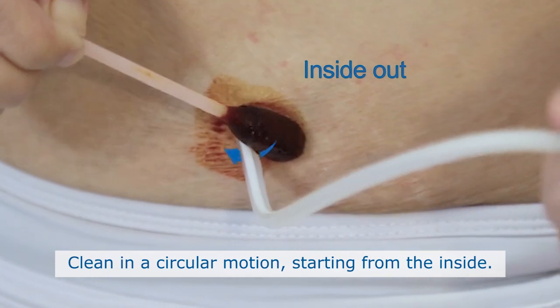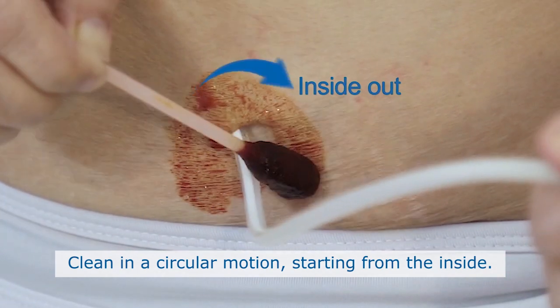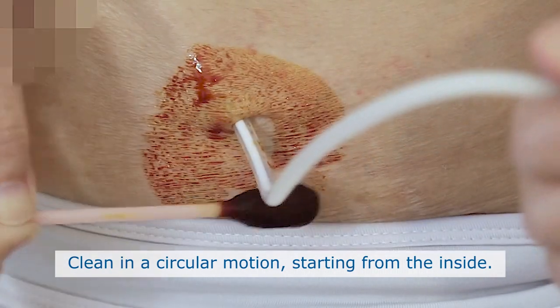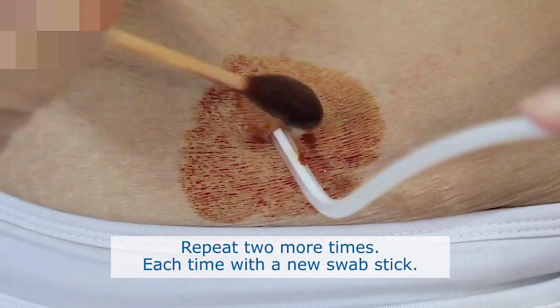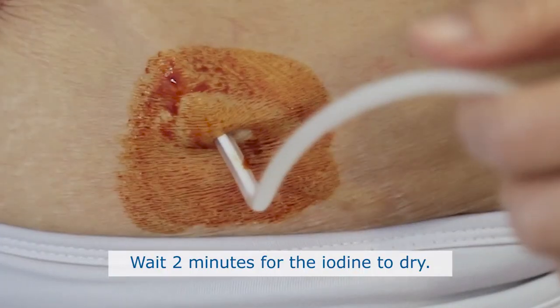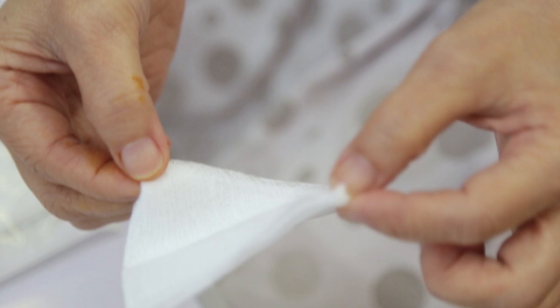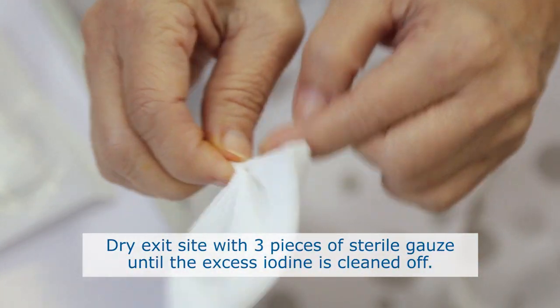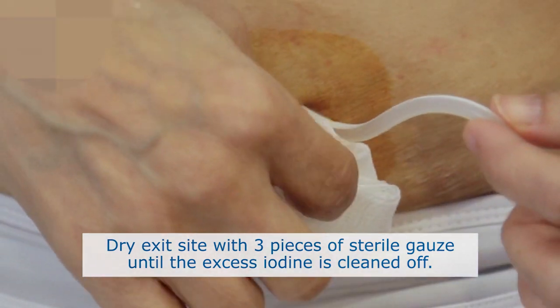Clean exit site using iodine swab sticks. Clean in a circular motion, starting from the inside and working outwards. Repeat 2 more times, each time with a new swab stick. Wait for 2 minutes for the iodine to dry. Dry the exit site with 3 pieces of sterile gauze until the iodine is cleaned off.